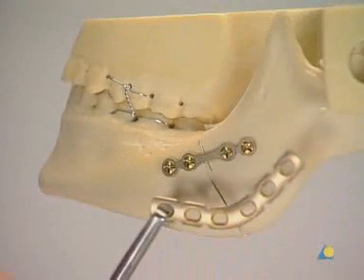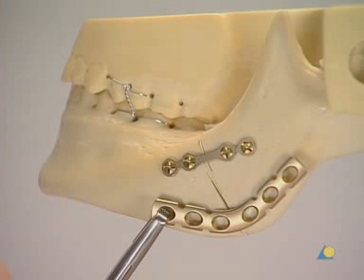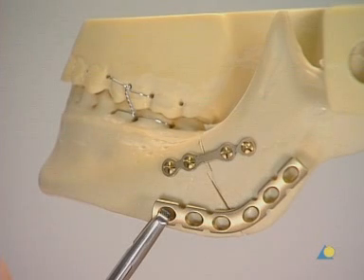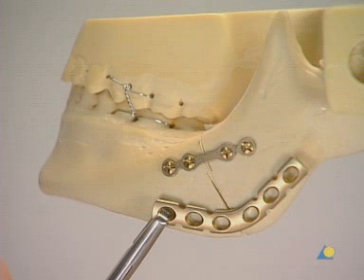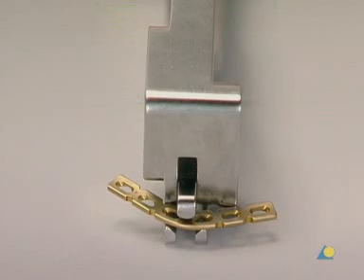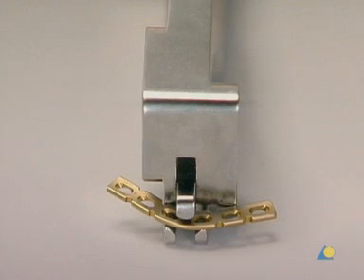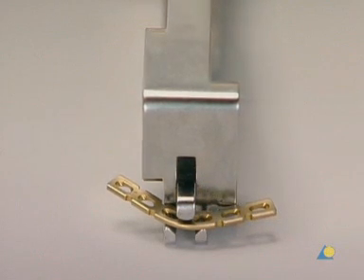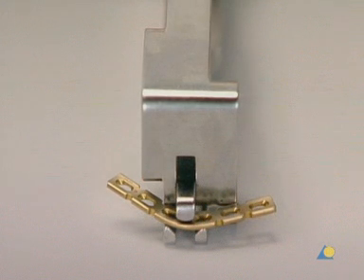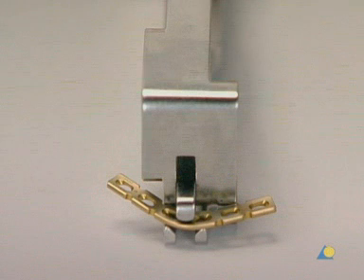An angled 2.4 universal fracture plate with six holes is selected to be attached to the lower border of the mandible, with three screws on each side of the fracture. The bending pliers are used to contour the plate precisely to the mandible. A small degree of overbending is advisable so that the fracture does not open up on its lingual aspect.